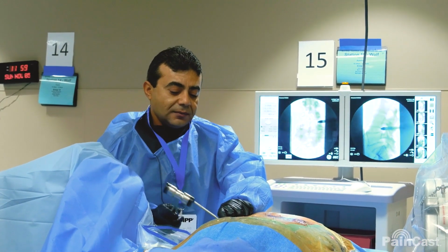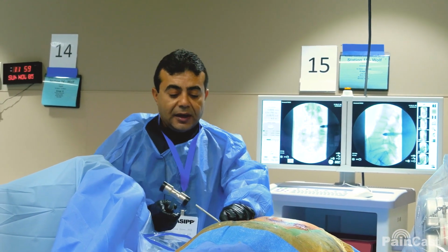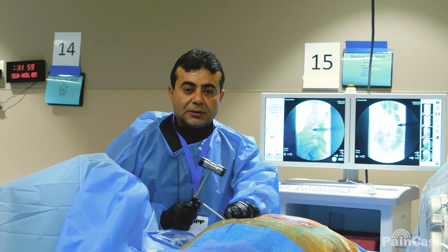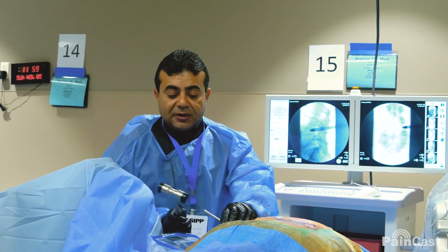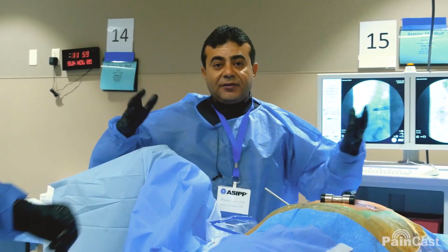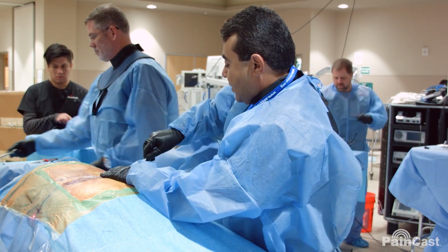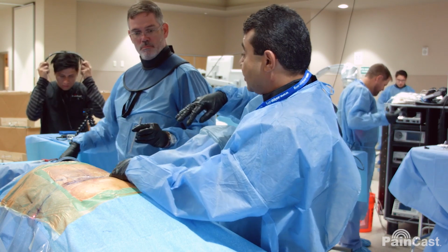So as we hammer, you always want to be in a lateral view, and you want to do a firm 3 or 4, and you're ready. And here it is. I see myself almost in the middle of the disc, and after that I'm safe. I can take my hands off. I know I am in the middle of the disc, going shallow.